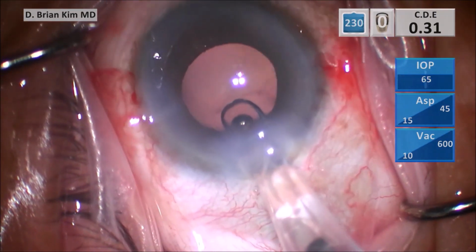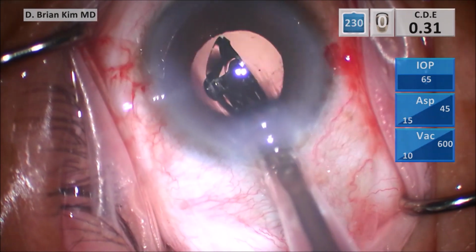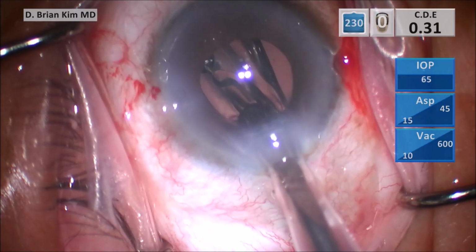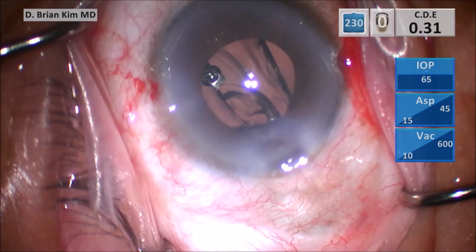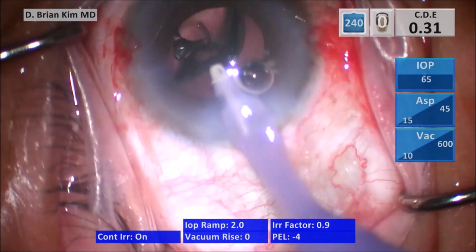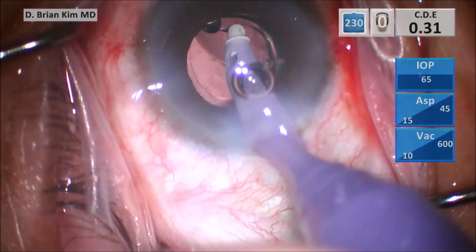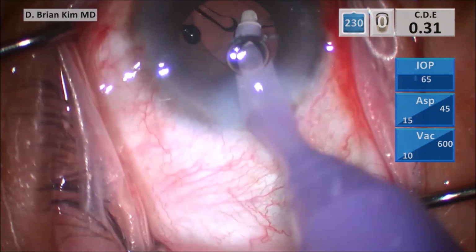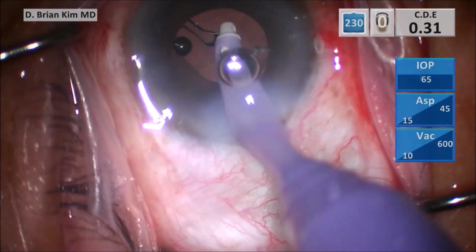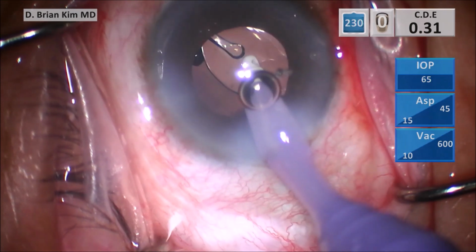And then now I'm injecting my single piece acrylic intraocular lens into the capsular bag. You can see here that as I deliver this lens, the haptic is actually stuck to the optic. And so you can see this trailing haptic is actually stuck to the optic. I'm going to try to tease that haptic off the optic using the I/A. Actually, both haptics are stuck to the optic here. I'm able to release the trailing haptic off the optic by using the I/A handpiece, but I'm not able to do that for the leading haptic.